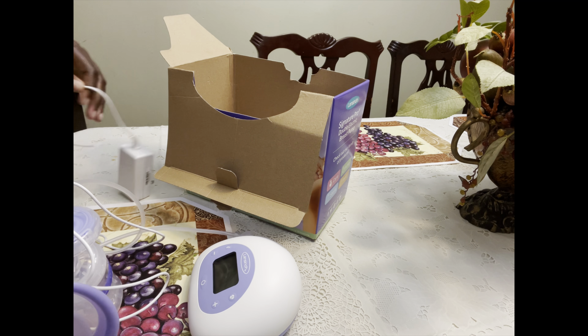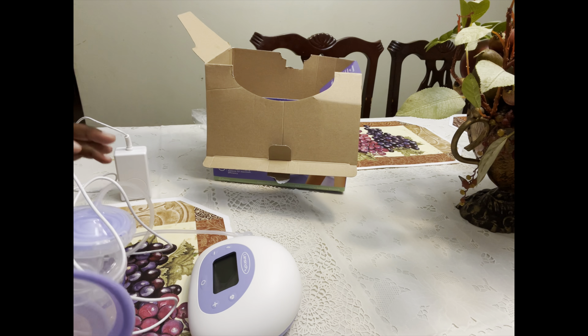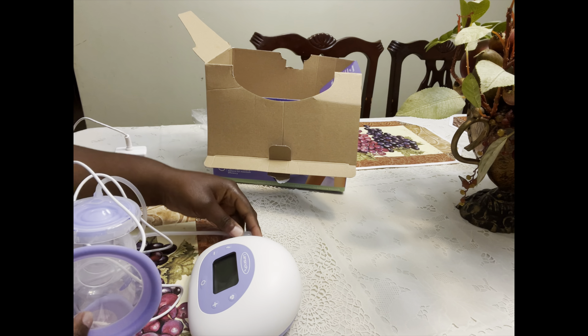Hey YouTube, Mama the GOAT here. I wanted to get on and do an unboxing plus story time with the Lansinoh Signature Pro double electric breast pump. This is really a reenactment — I ended up losing all my footage, so this is a reenactment, guys.